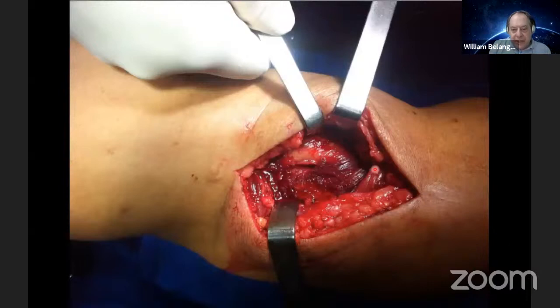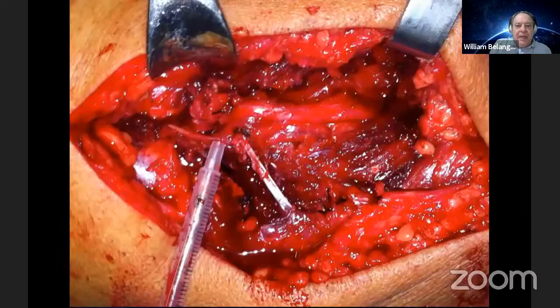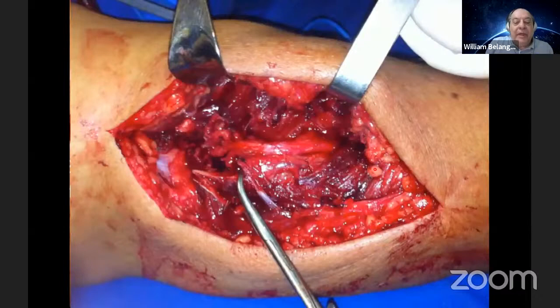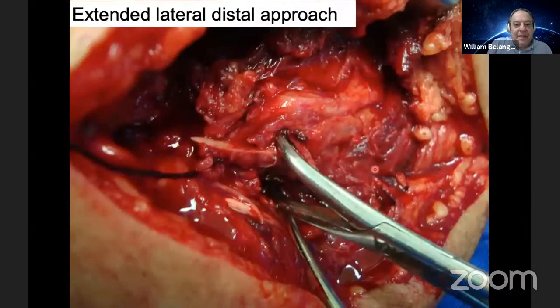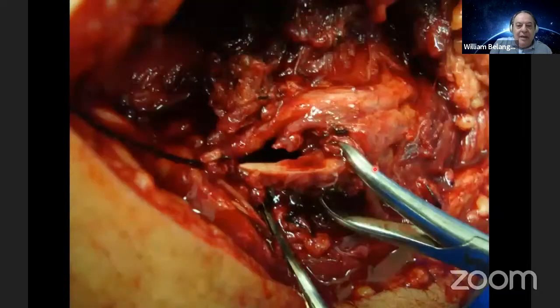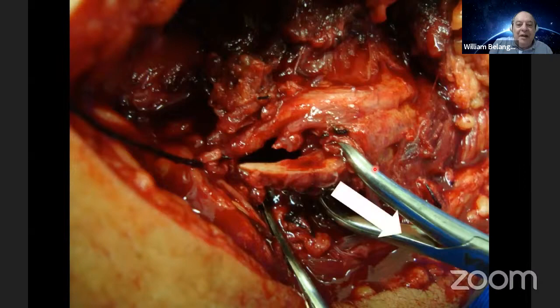We started with this lateral approach, and you see here the bone fragment and the radial nerve here. It's a very interesting image because in this image, you see that the radial nerve has gone inside the fracture. You see? Then we take the bone fragment and bring the radial nerve outside and protect it. This is the bone fragment. You see the radial nerve. This is the X-ray, and then you put the bone fragment inside and bring the radial nerve outside, as you see here.